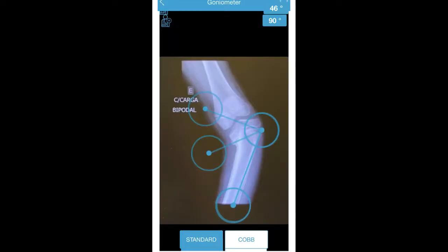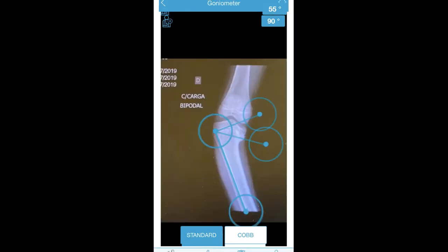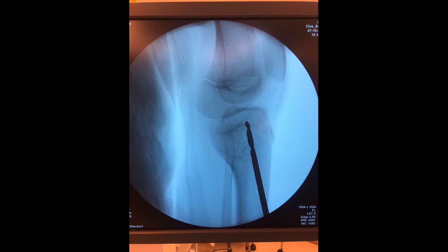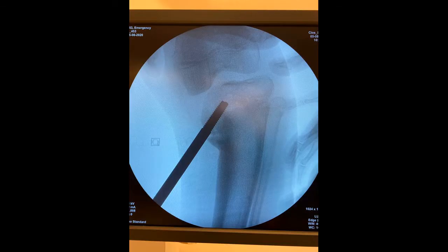Surgery was performed in stages, starting on the left side. We start with the preoperative visualizations in the lateral fluoroscopy. Then we insert the two proximal pins parallel to the medial physis in an almost vertical direction. Then we place the two more distal pins in the tibia.